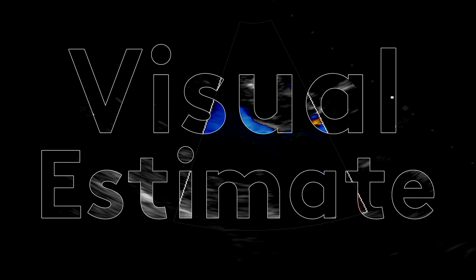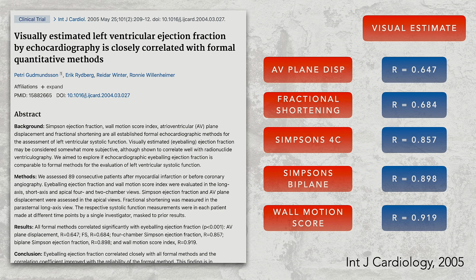But before we get into that, I want to show you a couple articles to prove that I'm not making this stuff up, and this is actually supported in the literature. And if you look at the literature, there's a number of articles that go back into the 80s and 90s. We're not going to get into that. I want to look at two in particular.